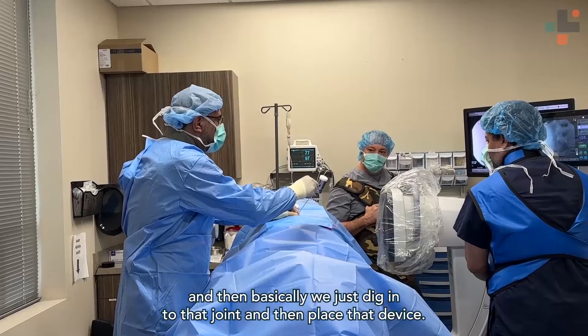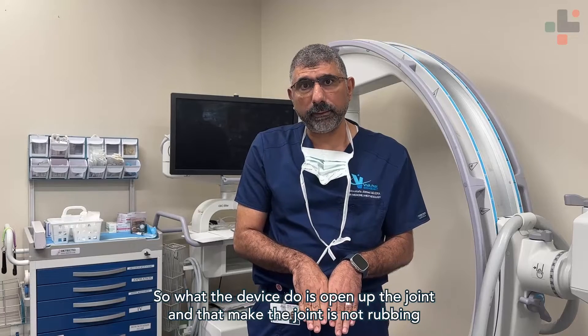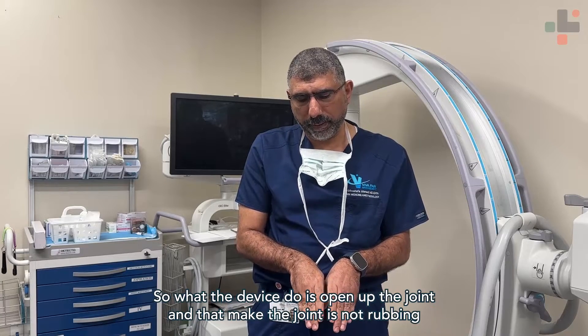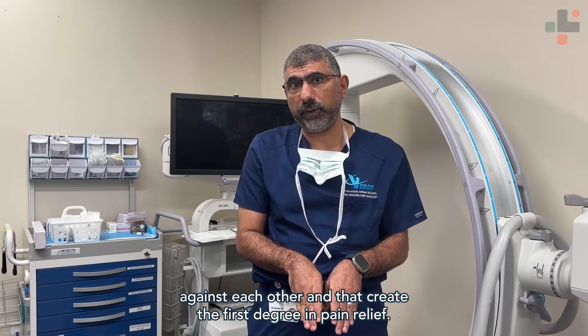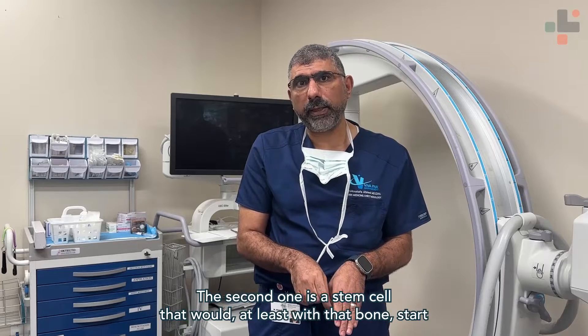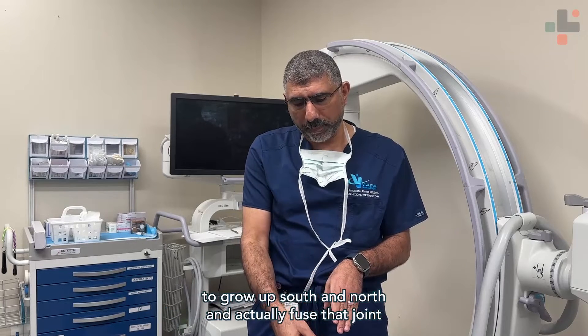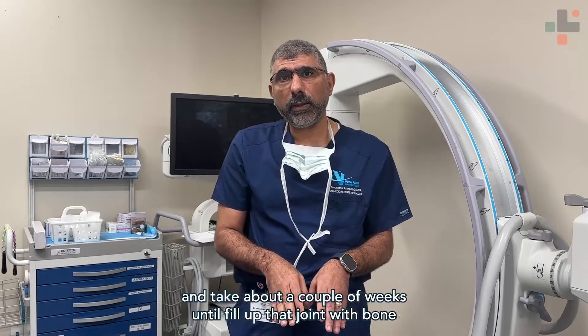We dig into that joint and place the device. What that device does is open up the joint so it's not rubbing against itself, and that creates the first degree of pain relief. The second benefit is the stem cells laced with that bone start to grow in both directions and actually fuse that joint, which takes about a couple of weeks.